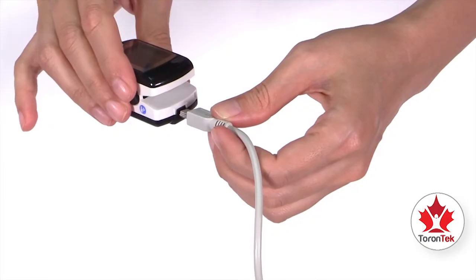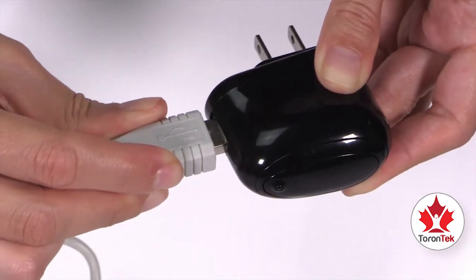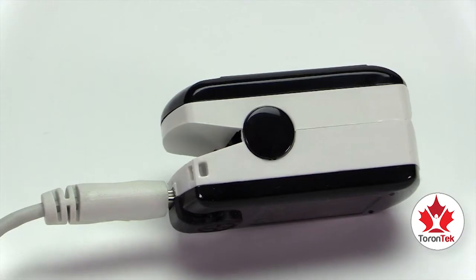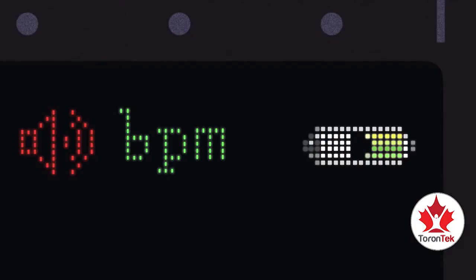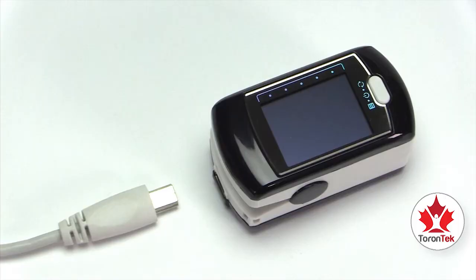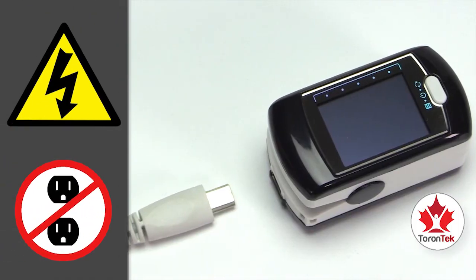Plug in the small USB connector to the device and the larger USB connector to the wall charger. Then connect the wall charger to the power outlet. Check that the charging light on the device is on. When the indicator shows the battery is full, unplug the device immediately. To protect your device against power surges, disconnect it from the charger during a power outage.